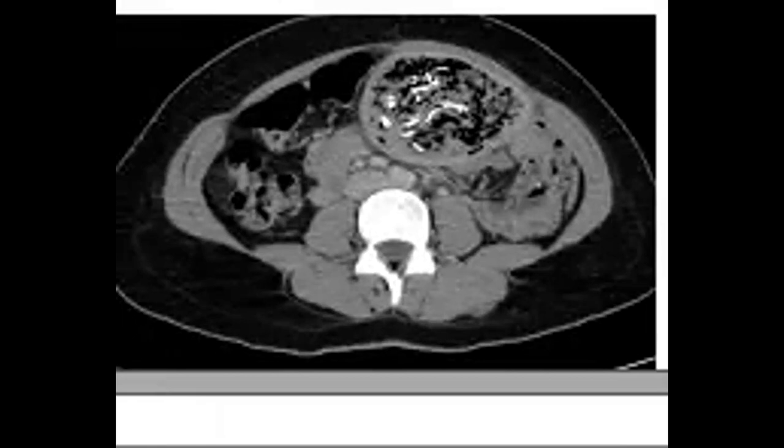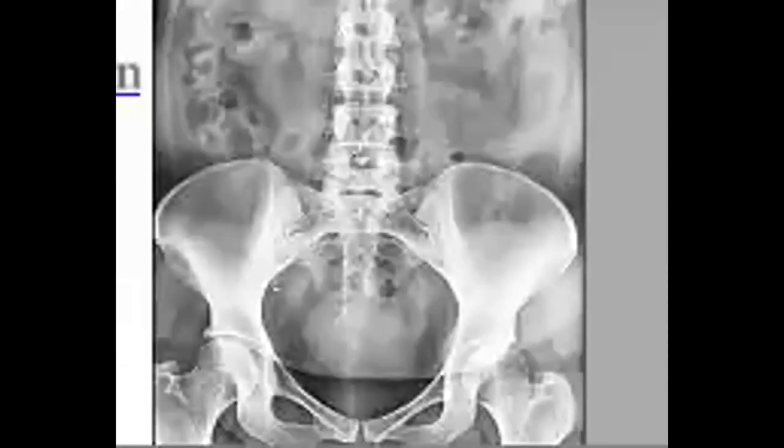Then the keyword in the question, if you find something about a procedure, like a recent surgical procedure, so we are talking about a missed towel or gossypiboma, as you call it. In the X-ray, maybe you can find the threads of this retained surgical sponge or whatever, and an inflammatory process around. So the keyword will be the surgery in this case.